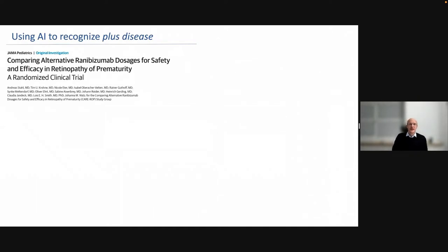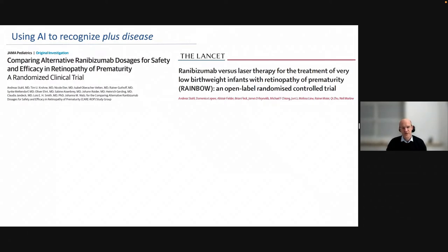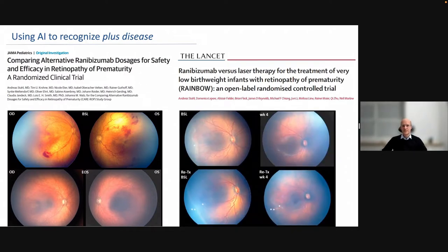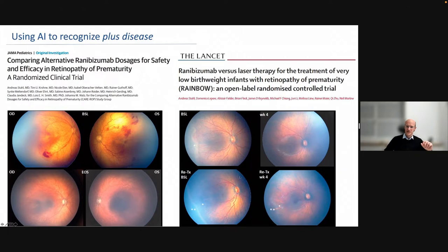And this is what we try to do. To do this, you need a multitude of images — you can't do this on a single sample photograph. Fortunately, we have clinical images from clinical trials with infants with ROP — at baseline, end of study, and importantly, in between. Here's an example of a patient who goes from baseline, after treatment, to a very good disease stage four weeks later, but then experiences a reactivation only six weeks after. We see again vessel tortuosity, dilatation, and peripheral ROP changes — this needs to be retreated.